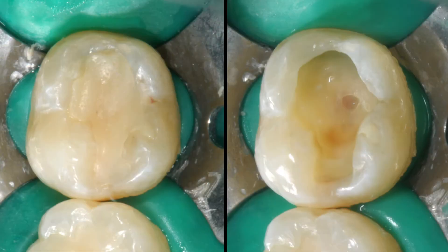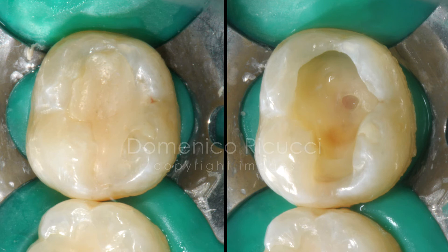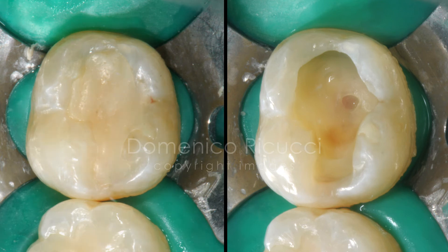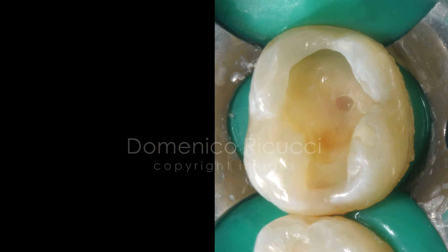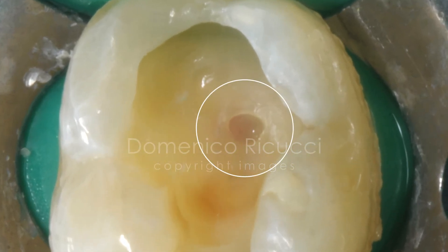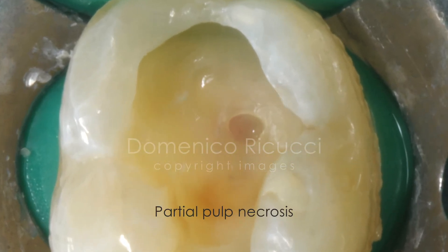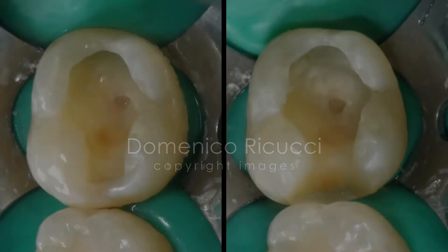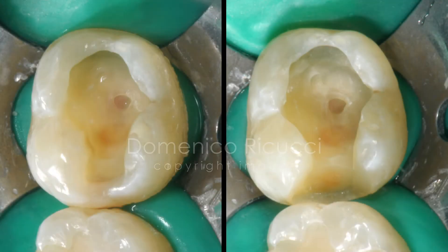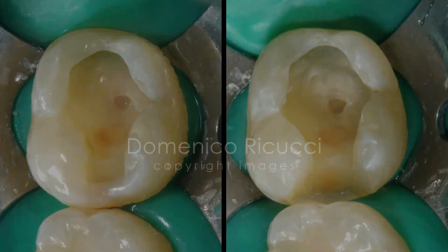After removal of the restorative material, a pulp exposure in the area of the distal lingual horn appears with avascular pulp tissue, indicating partial pulp necrosis. The interproximal caries is accessed and the caries dentin meticulously removed.